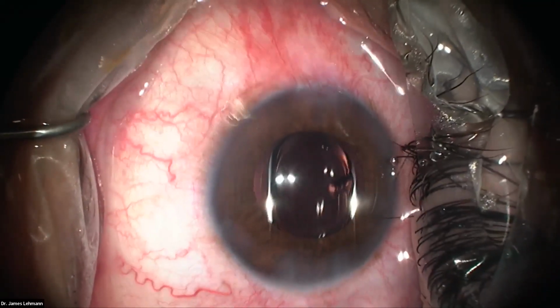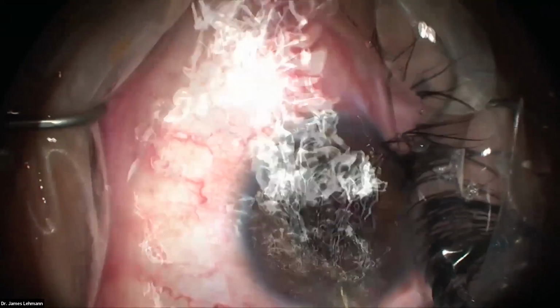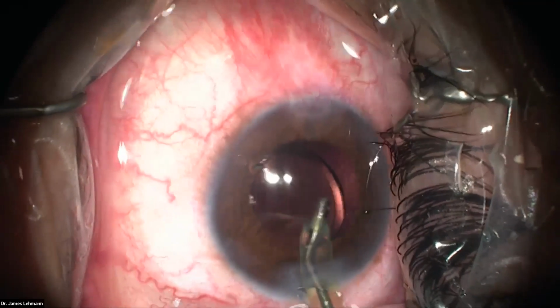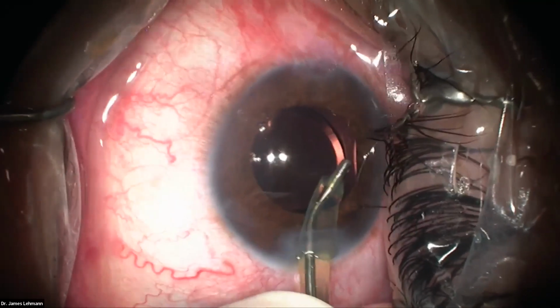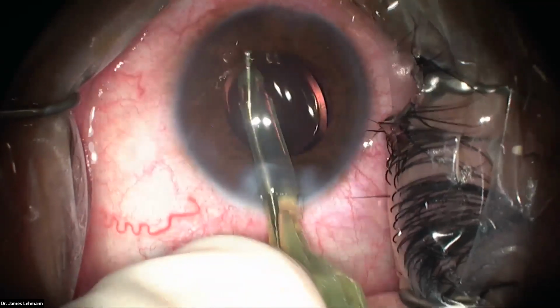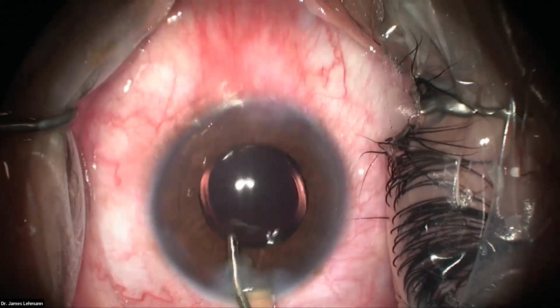Now I&A again with a little higher vacuum setting. Continuous irrigation on. And now we just remove that cohesive viscoelastic all around the lens there. There's a little piece of cortex kind of lingering over there. I'll move the lens towards it and I'll go under it. See if I can get it. Looks like it's gone. And now just removing all the cohesive from the anterior chamber.